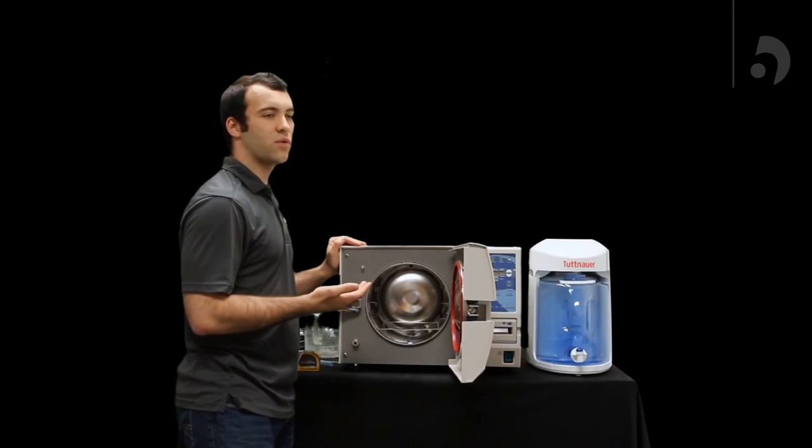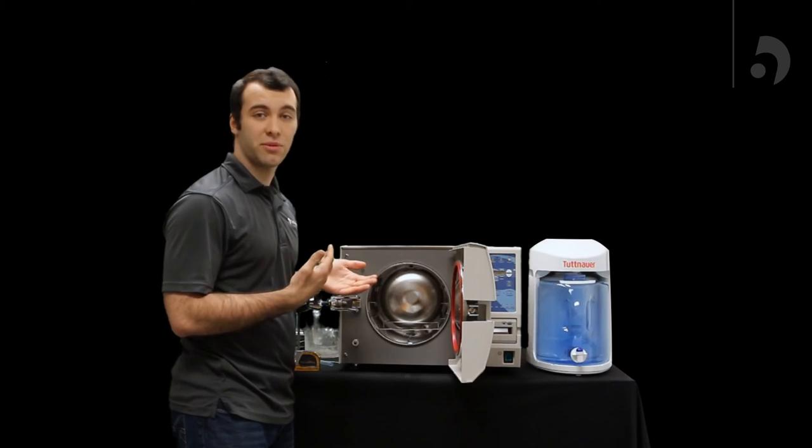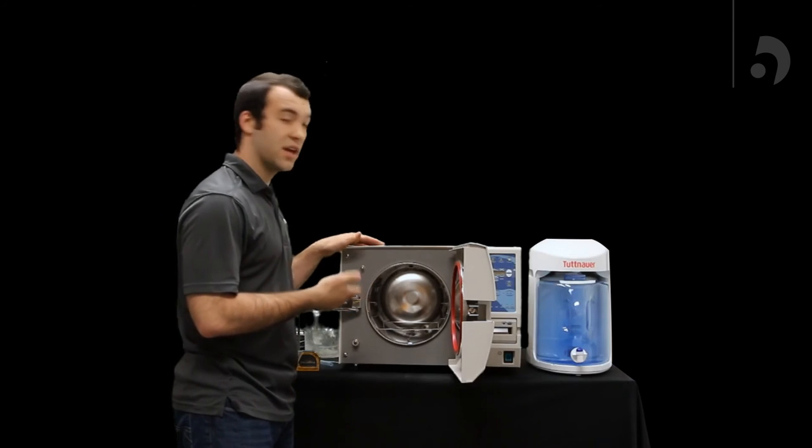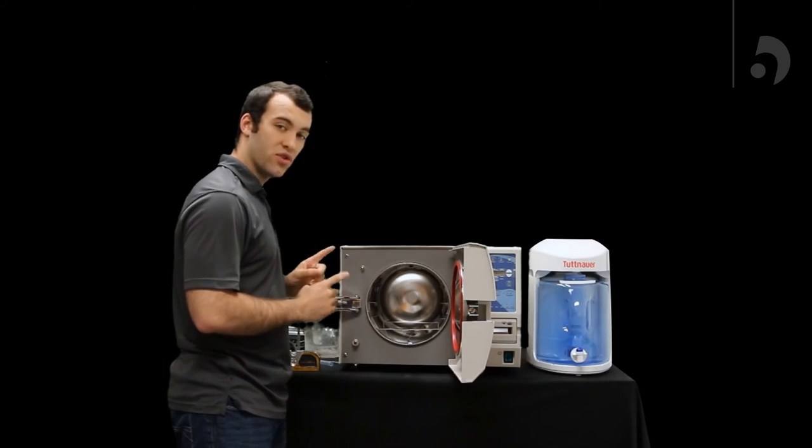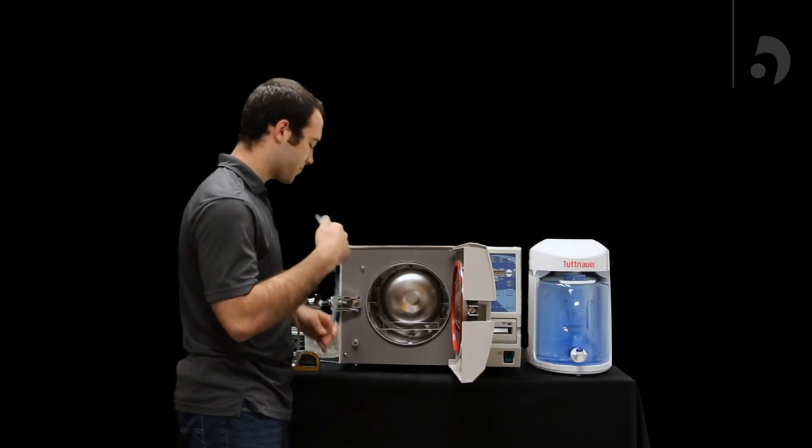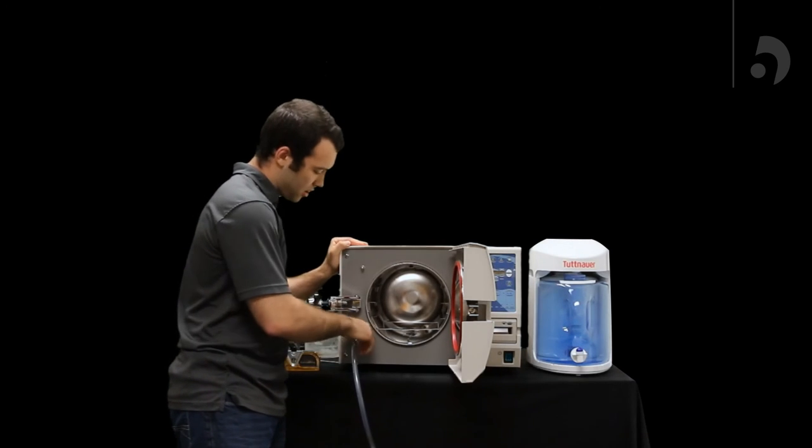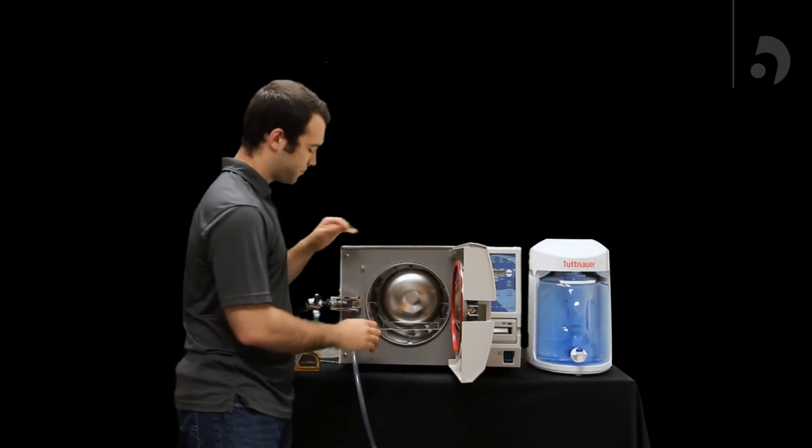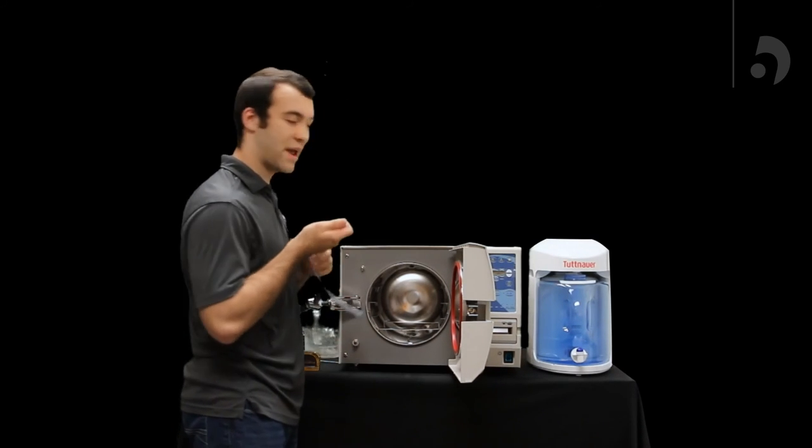Now, another thing with the water in the reservoir is that after about a month, maybe faster depending on how frequently you use your unit, it can start to get dirty and we recommend draining it within that time. So to drain that water, you use the tube that comes with your unit, slide it on this drain right here, twist it counterclockwise, and the water will start coming out. From there, you can just fill your reservoir back up.